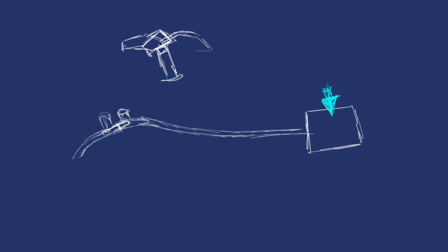If we put this into the patient's nose and they breathe off CO2 into this, we can't zero to the atmosphere out here if we're zeroing to this in here. So if you're zeroing the equipment, it needs to be detached from the patient so we can zero it to the atmosphere, and then we can plug it into the patient so we can see a difference between the atmospheric CO2 and the CO2 that's being expelled.